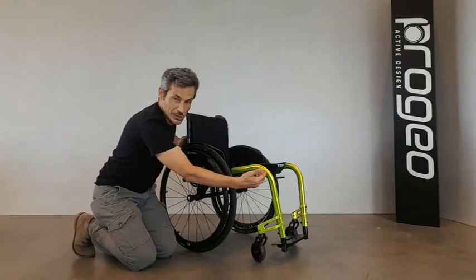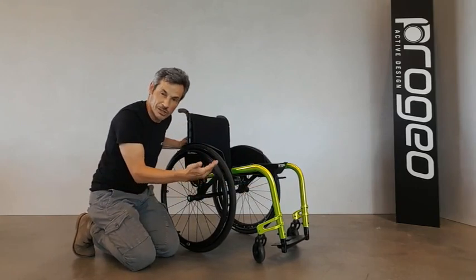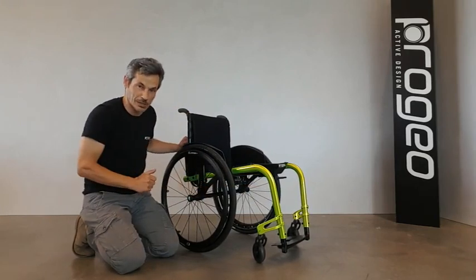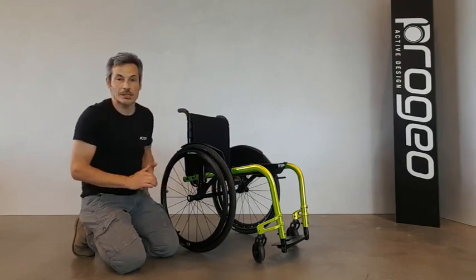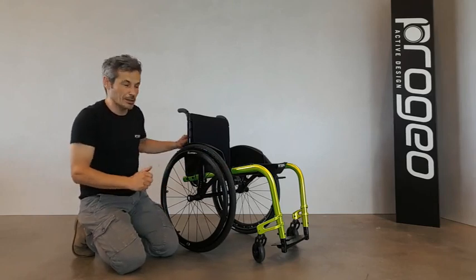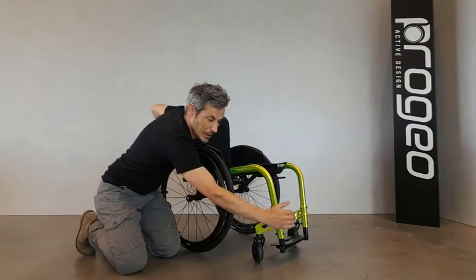The frame of the wheelchair is made of aluminum alloy 7020 with an elliptical section to give extra strength, and it always follows proportionally the seat depth of the wheelchair. It is available in three different angles: 85, 90, or the more open angle of 100 degrees.